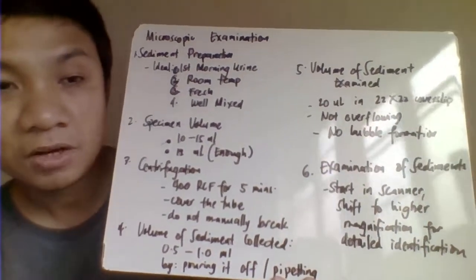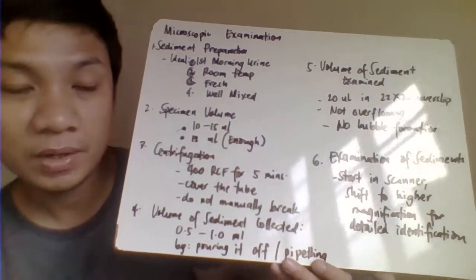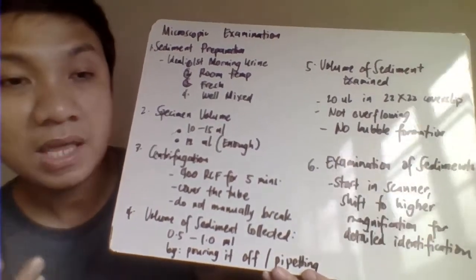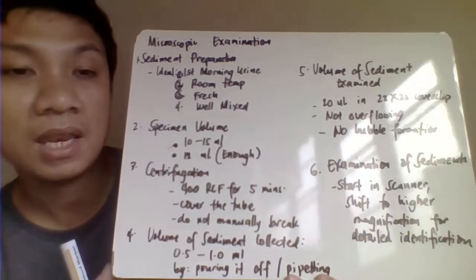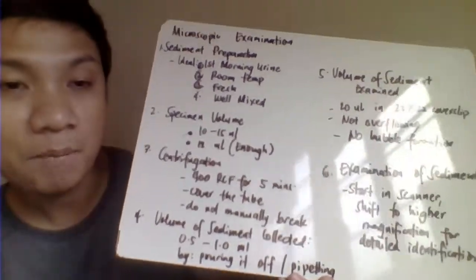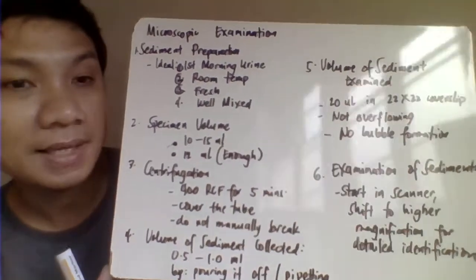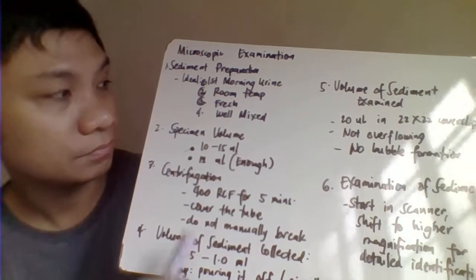When we drink water, then eat, and with any intake, we tend to urinate every now and then, so our sample becomes diluted. And that would not provide us with the correct number or concentration of cellular sediments to diagnose someone with a medical condition.